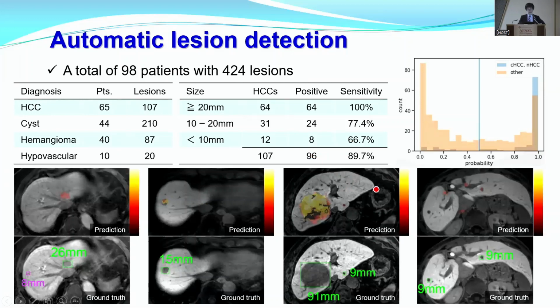However, sub-centimeter regions sometimes cannot be detected due to the poorer liver to tumor contrast or poorer image quality. So images with deep learning reconstruction or deep learning super resolution can increase the diagnostic performance for our AI model.